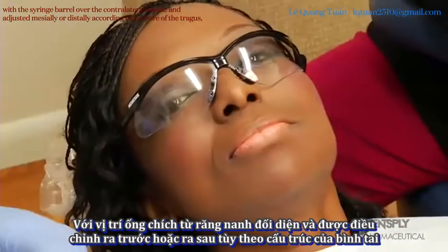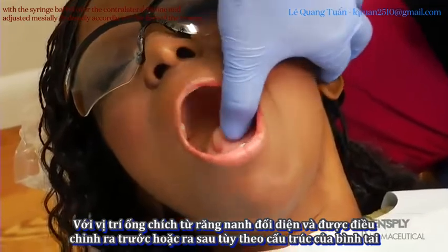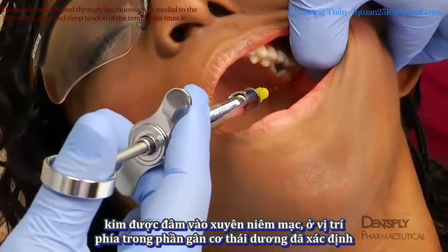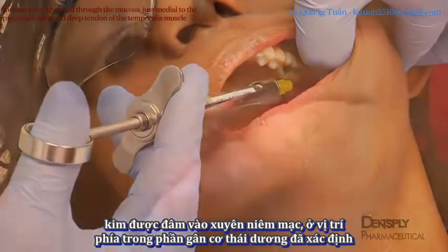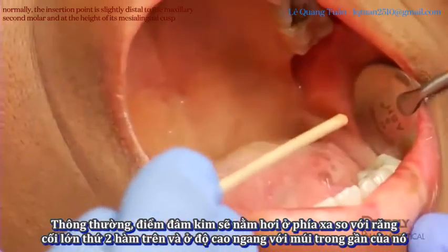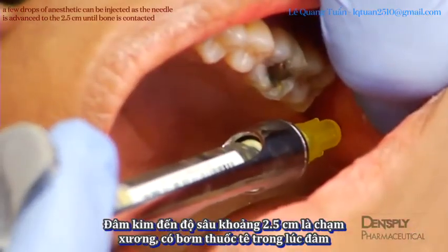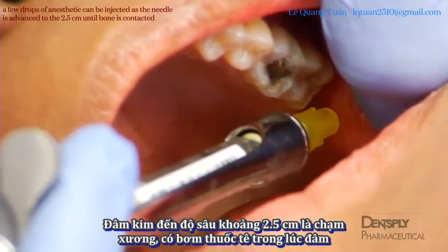With a syringe barrel over the contralateral canine and adjusted mesially or distally, according to the flare of the tragus, the needle is advanced through the mucosa just medial to the previously palpated deep tendon of the temporalis muscle. Normally, the insertion point is slightly distal to the maxillary second molar and at the height of its mesial lingual cusp.